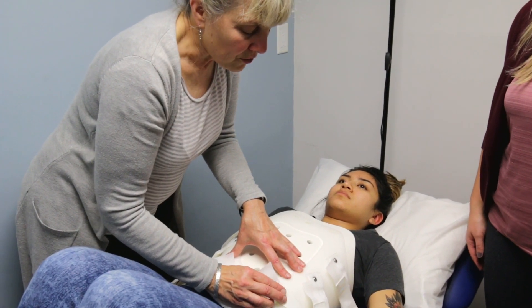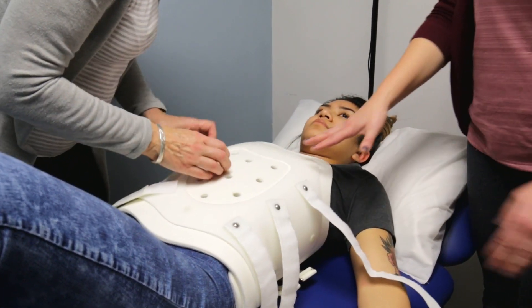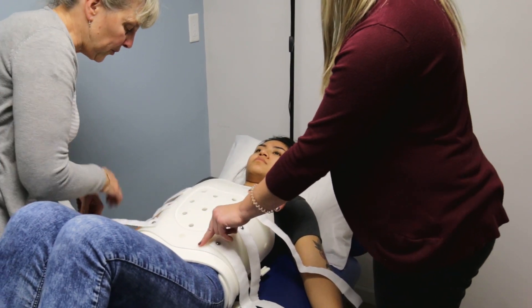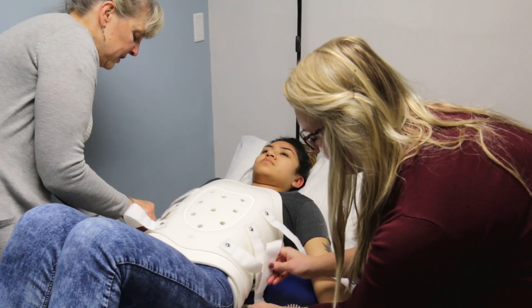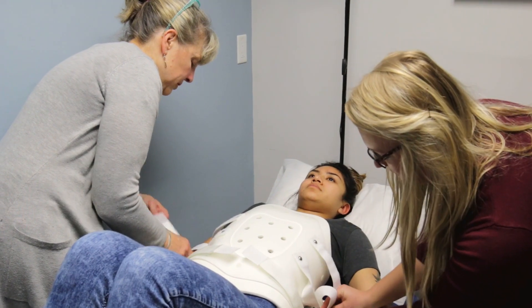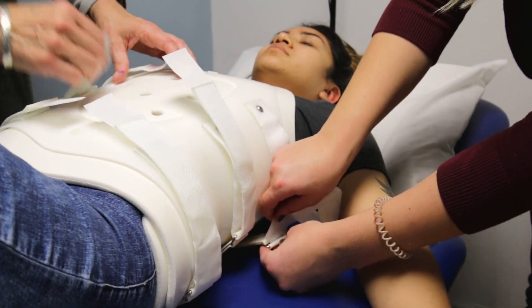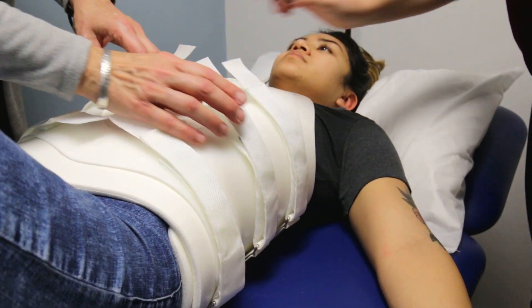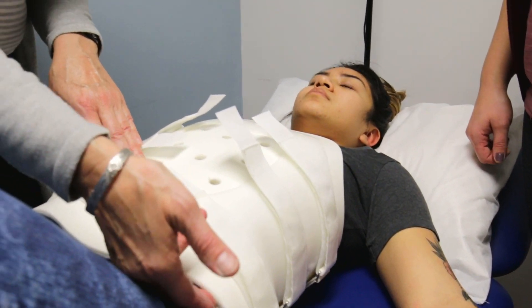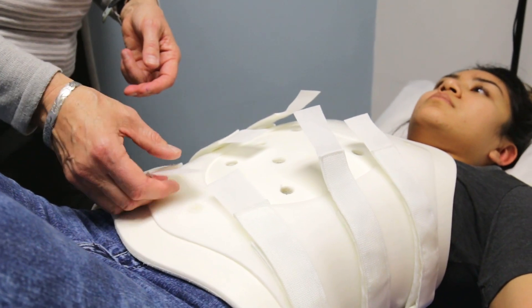There are six straps, three on each side, and you're just going to thread them through each one of the D-loops. It doesn't matter if you start top or bottom — just touch them down at this point without tightening. For tightness, we usually don't mark the straps because it changes quite regularly. What we're looking for is two fingers underneath as our tightness guideline.